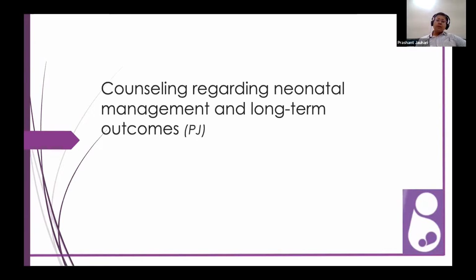So again, as you said, there are cerebral findings. But first, let me take the case where we don't have a cerebral ultrasound finding. In that case, the chance is very low. People have studied that if the prenatal MRI and the extended neurosonogram are not showing any abnormality, then the chance would be somewhere around 1 to 1.5%, and of severe disease it is almost 0%.